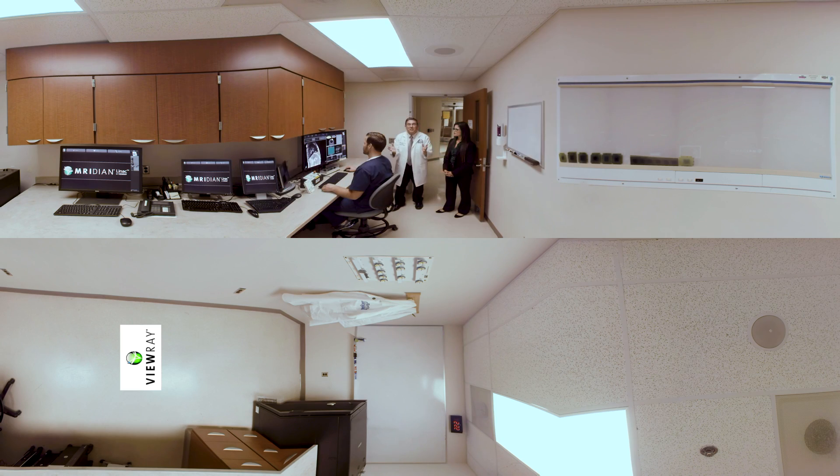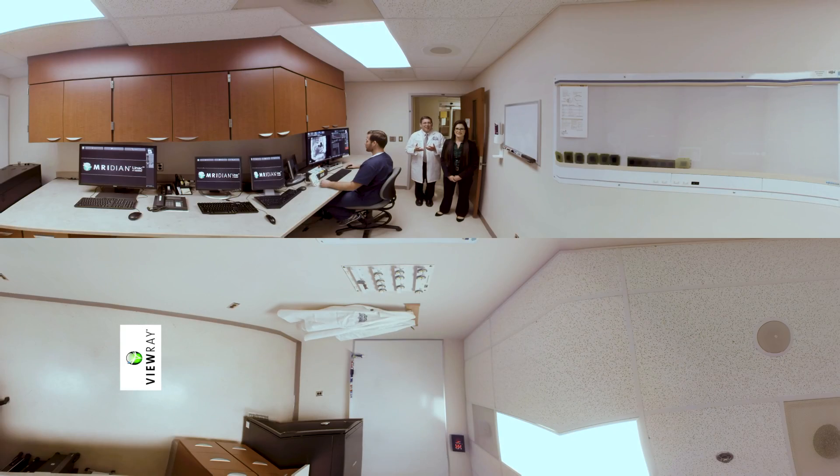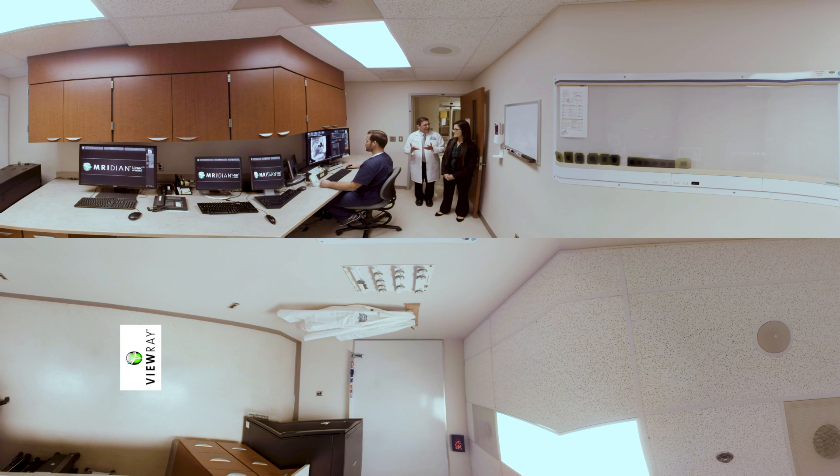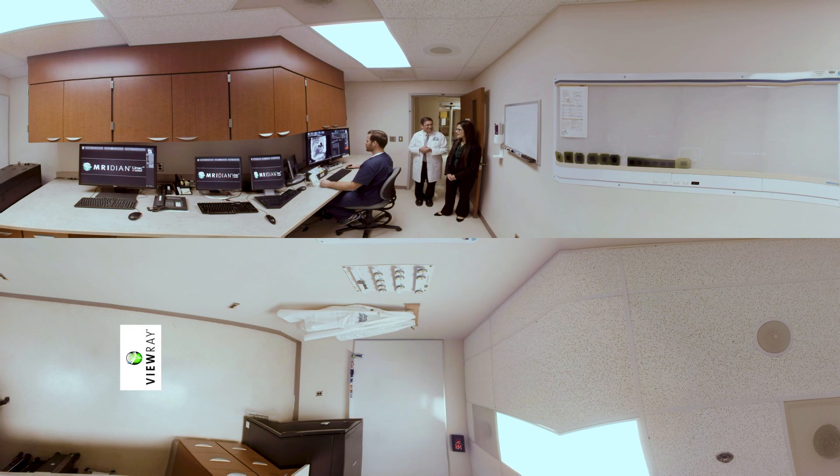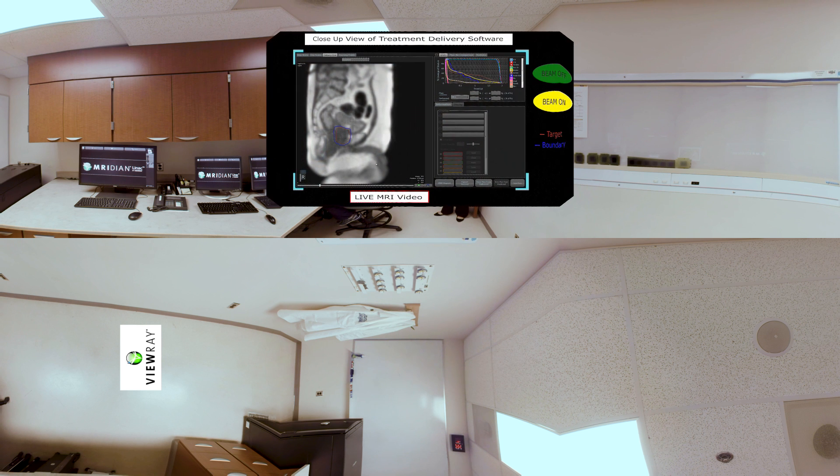So this is very exciting. Here's an example of real-time tumor tracking for a patient with prostate cancer. So what are these colored circles on the screen here?